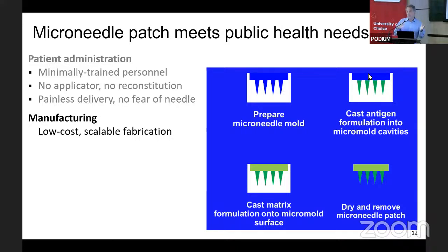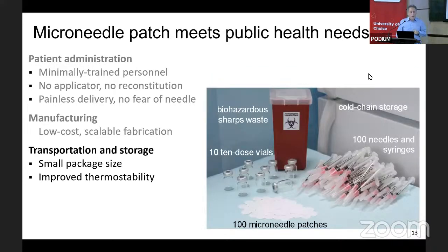So competitive, say, with the cost of a pre-filled syringe. For transportation and storage, there's obviously a small package size. These microneedle patches are small, and part of the reason is we get rid of all the water. Most of what's injected in an injection is water with just a little bit of active that's in there. So we're able to make things very small.